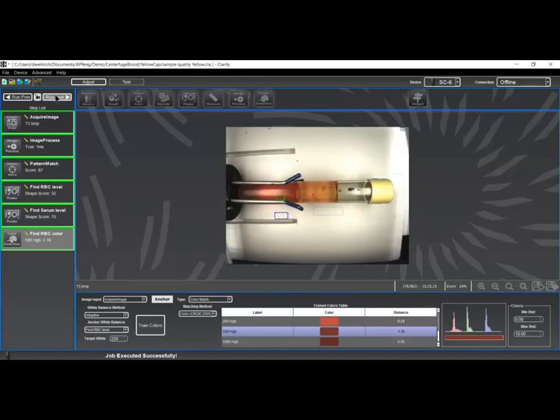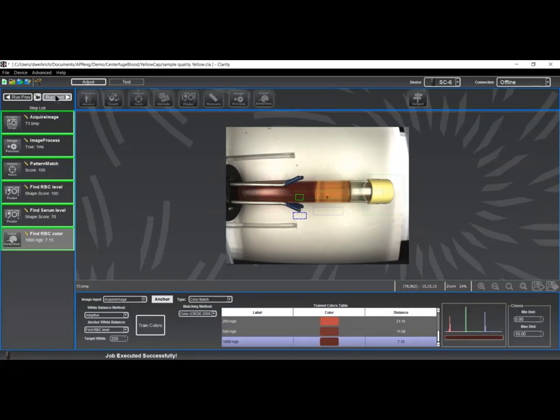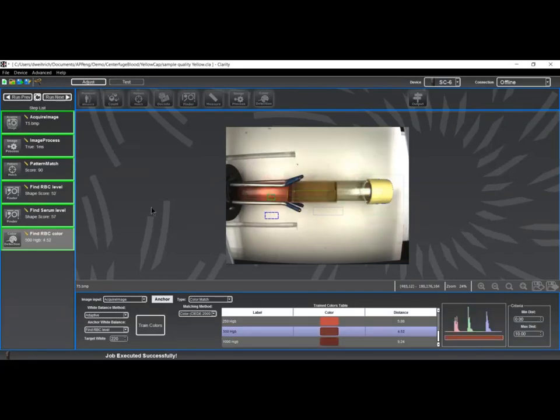It's interesting to note that as we select out colors in the bottom here, this is basically the color that we're matching according to this reference chart. And you see the color that we're matching is not necessarily the color you might see visually in this picture because of the action here of this adaptive white balance region and how that affects the color of the sample that's taken.